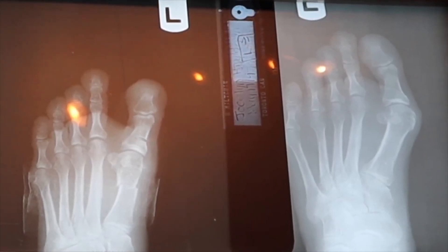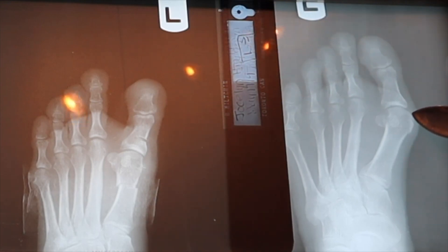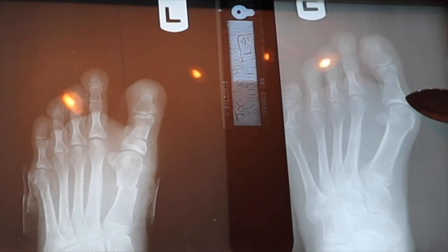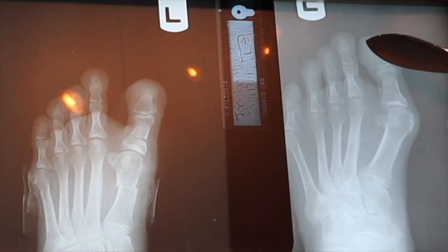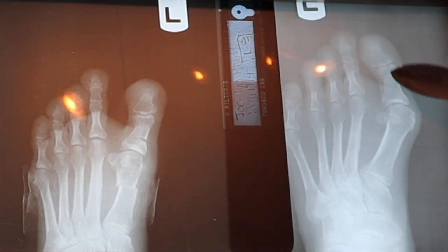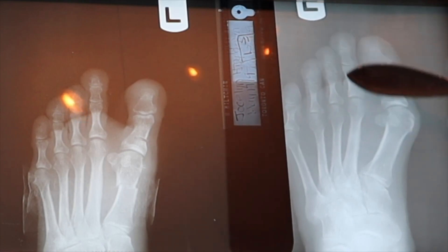Here's what the before and after x-ray looks like. In the pre-surgical x-ray we can see the first metatarsal protrudes medially. There's some medial eminence and the big toe hallux moves laterally. In this area we see an angle rather than something that's straight.